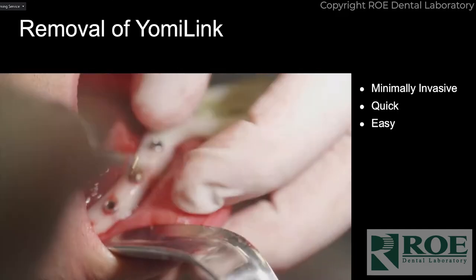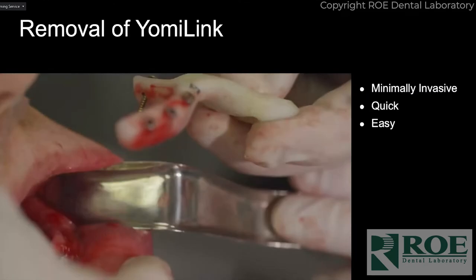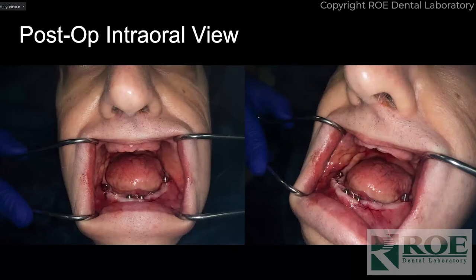This is removing the edentulous splint — it literally takes a minute, maybe a minute and a half, and then you just have these really small holes. Postoperatively there's zero issue. The new Yomi link has seven holes in it and a slightly different shape, but it is fantastic — you could literally pick the patient up when it's in. This is our post-op image: we've sutured up, multi-unit abutments are placed. I did a little envelope incision and slight bone reduction for this case, just a couple of interrupted sutures. He was a post-heart-attack patient so I didn't want to be too aggressive.